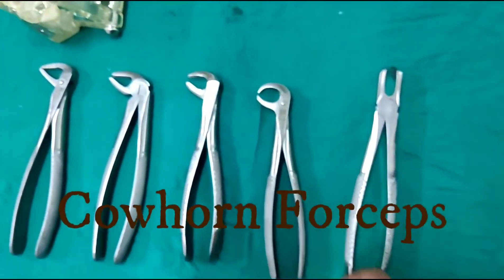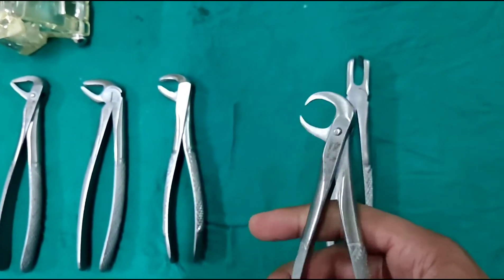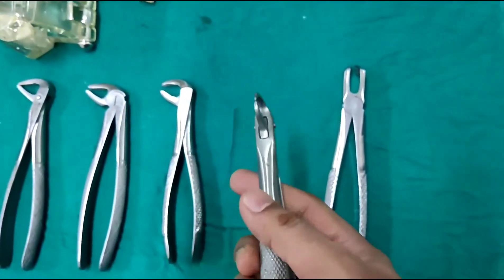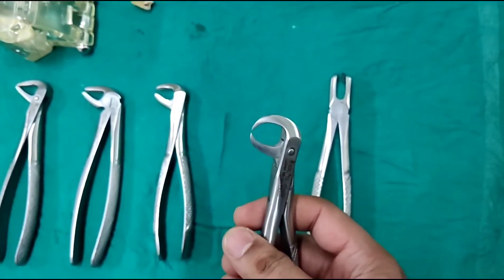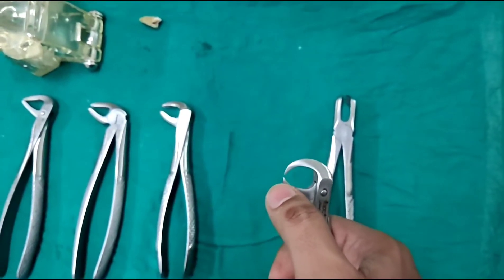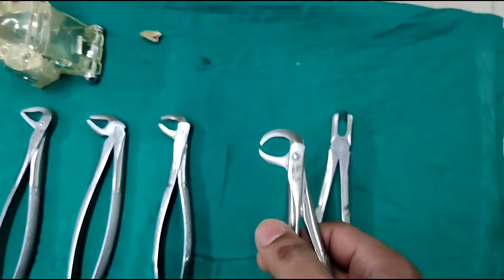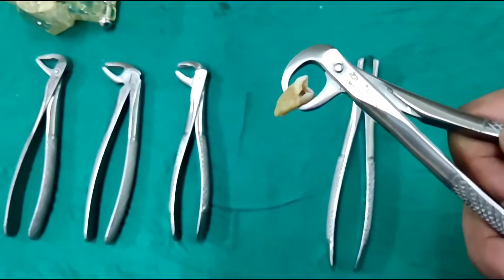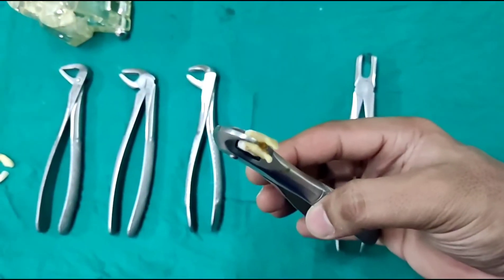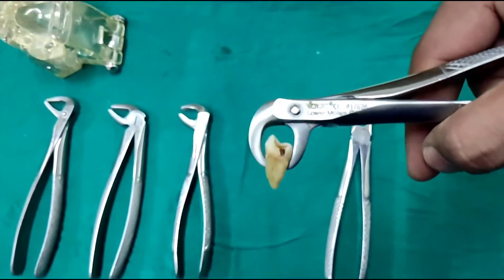The fourth forcep is called the cow horn forcep, named because of the shape of its beaks, which are designed like a cow's horn. The tip of the cow horn forceps is angulated towards each other and is very sharp and pointed. This tip enters into the furcation area and generates a force that elevates the tooth out of the socket. As you can see here, the tips of the cow horn have entered into the furcation area, and when you press or engage the cow horn, it elevates the tooth out of the socket.